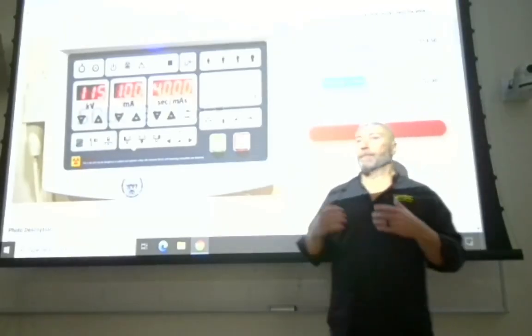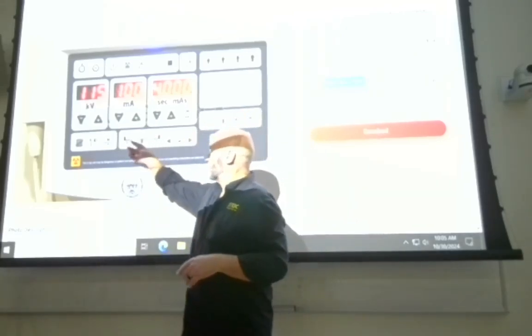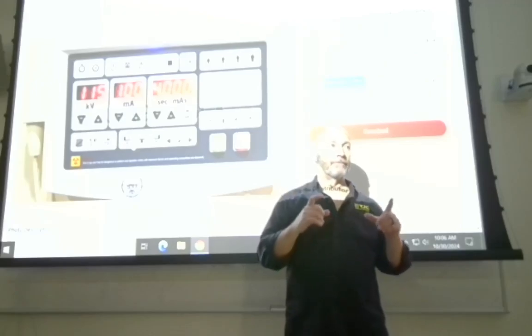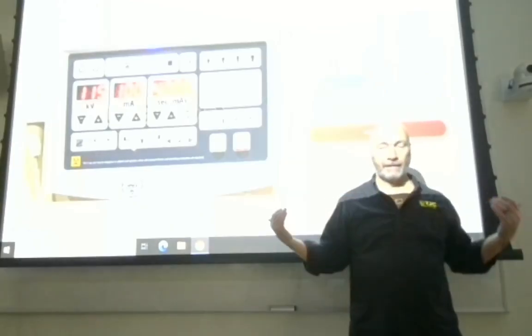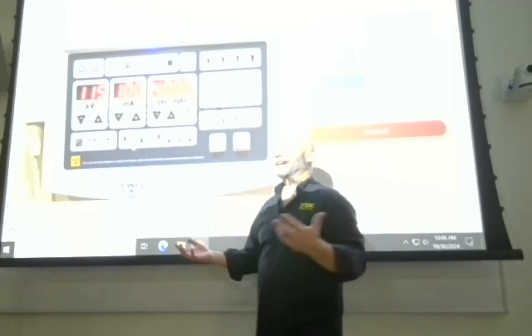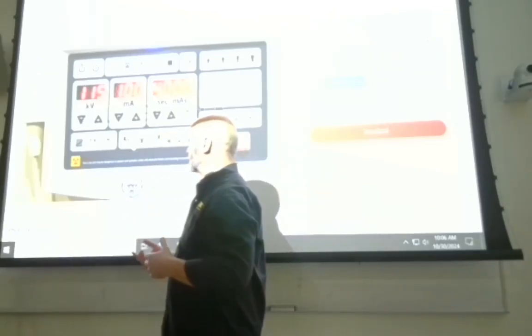All right, so you make an exposure on an abdomen, then you can set these radiation detectors, and those radiation detectors are designed to take a certain amount of radiation and terminate the exposure, completely kill the exposure when they receive the right amount of radiation. So let's say it's not an abdomen, because you can have a number of configurations for an abdomen.